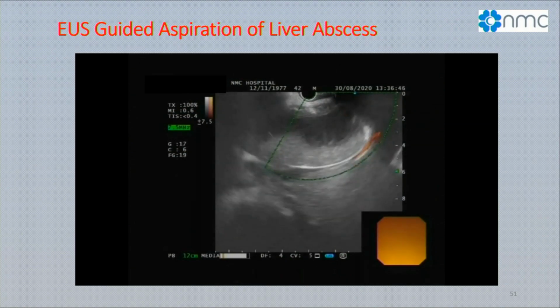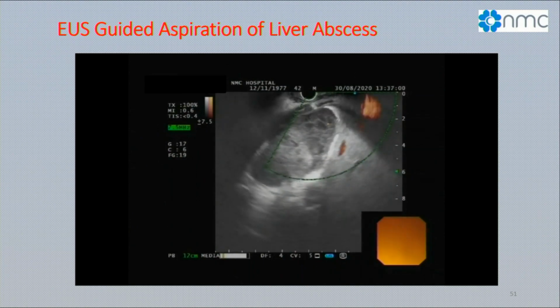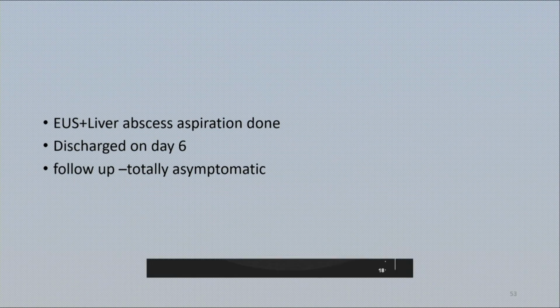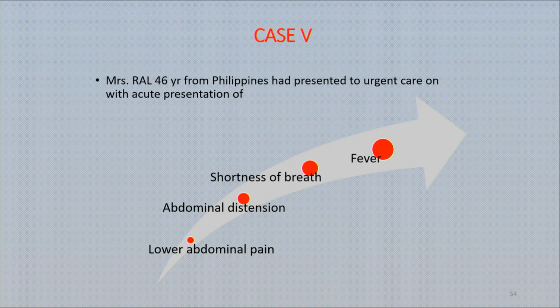The patient was given antibiotics as per the culture results of this pus, and the patient got relieved. He avoided interventional procedure, he avoided surgery. So this is the advantage of a minimally invasive technique to treat these patients. This was follow-up after 8 weeks. There was entire resolution in symptoms.